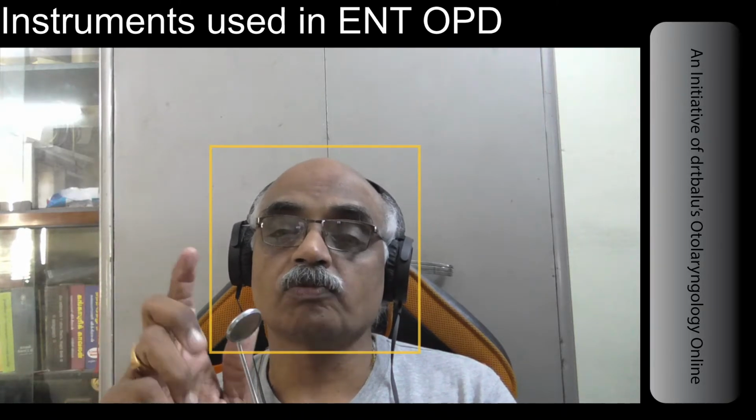If you are using a spirit lamp, you ensure that you warm the glass portion of the mirror, not the metal portion, because the coefficient of expansion of the metal is larger than that of the glass. So if you warm the metal portion of the laryngeal mirror, the glass will fall off. So warm the glass portion by showing the mirror side of the laryngeal mirror to the spirit lamp, so that the mirror won't fall off.